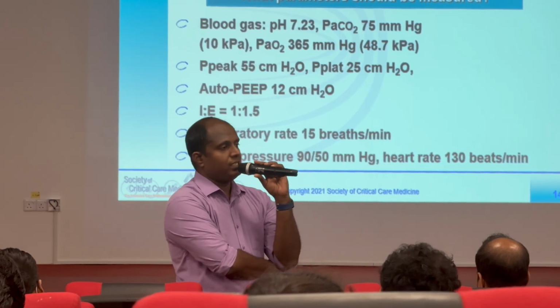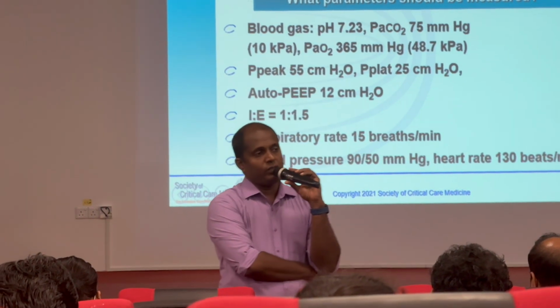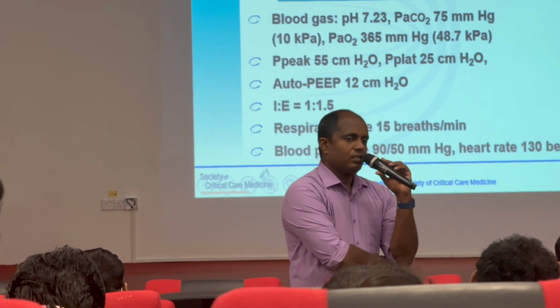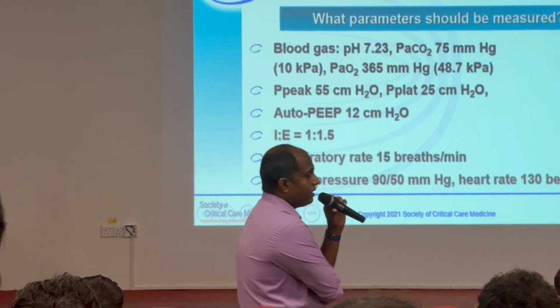The third setting is IE ratio, usually more than 1:2. We start around 1:2.5. And respiratory rate, what is the respiratory rate? That's an important physiological understanding you should have.